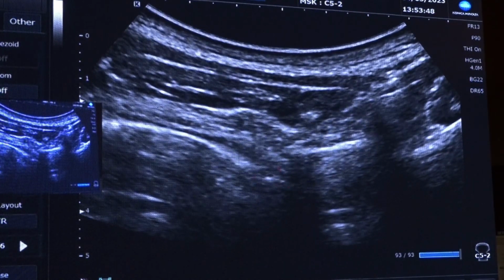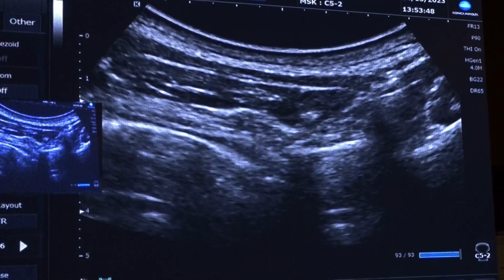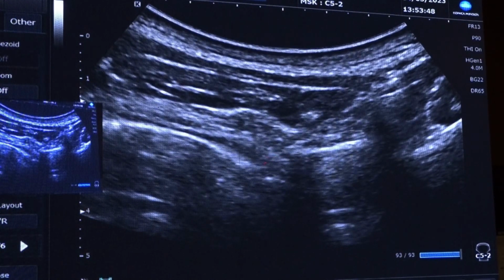And if any of you are pain physicians here, you can see that dorsal root ganglion injections require you to prepare for the injection a long time. It's quite a complicated preparation. You cannot do it in the office. But this may be one way in which you can inject a very small volume of local or whatever at the dorsal root ganglion just over there. So these are some new ways. This new anatomy is opening up new avenues for more targeted injections.